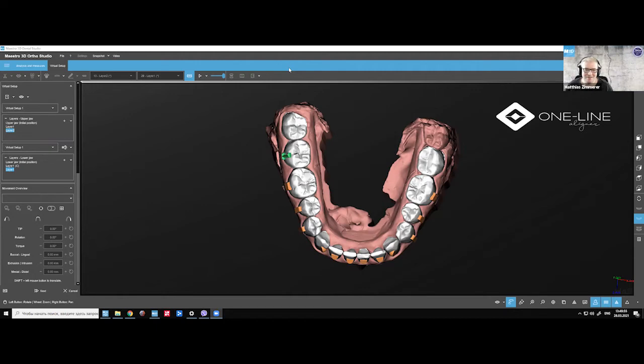Okay, so I'll be trying it next week, and I'll be posting maybe a small video or a small post about the clear aligner, if it works really, and how it feels in the mouth. So I'm going to try it on me actually. I'm going to try it on my mouth, and see how it actually feels. I cannot try it on the patient, so I'll try it on myself, and they'll see.